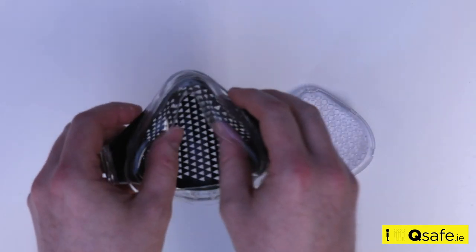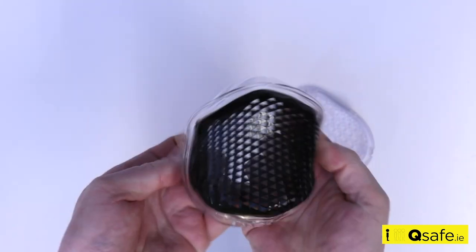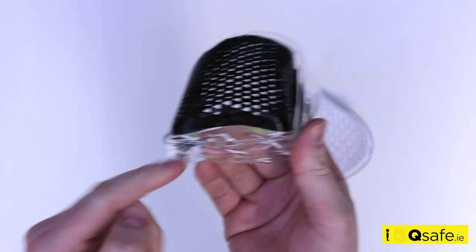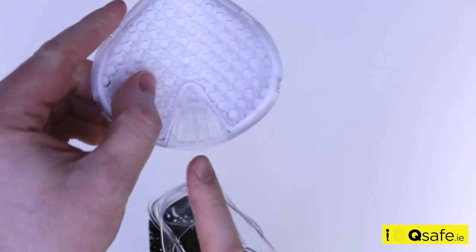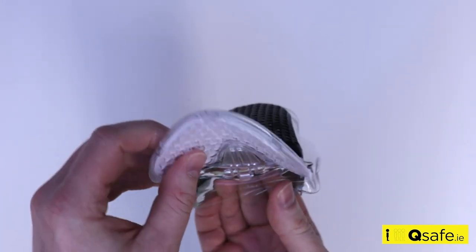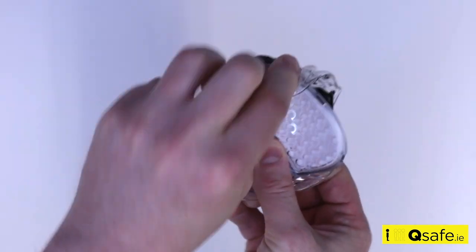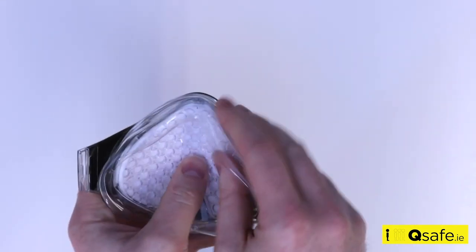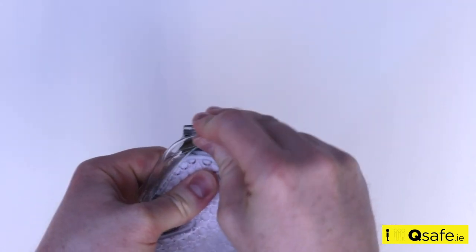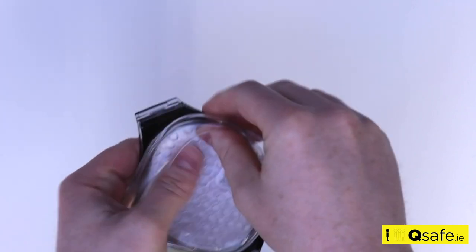To reinsert the filter housing, you can turn the mask inside out so that the four small pins align with the pin holes in the silicone mask, then stretch the mask body around the filter housing. Check around the edges to ensure that the silicone lip on the inside of the mask securely fits around the filter housing to give a good seal.